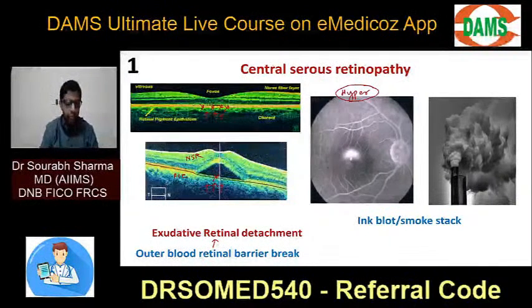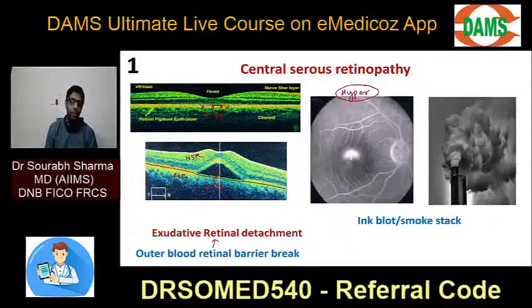Yes, very good everyone. Dr Sharma, if you see the anatomy of your blood supply, the choroidal vessels are first from the ophthalmic artery. Blood goes first in the choroidal artery, then it goes in central artery because the central artery is closer to the eyeball. Okay, so dye will also go first in the choroid. Alright, yes, very good, Sandra.